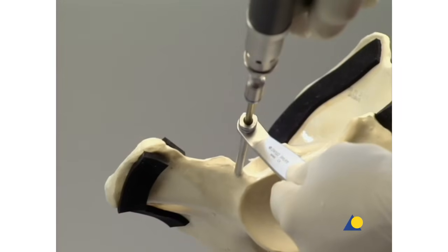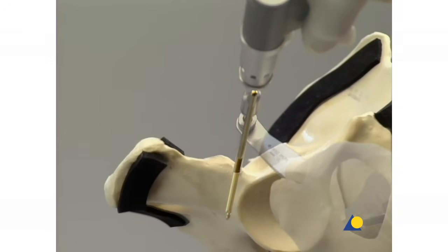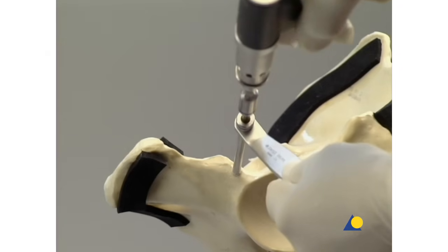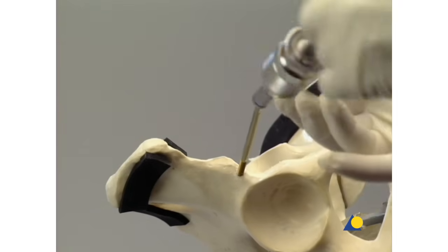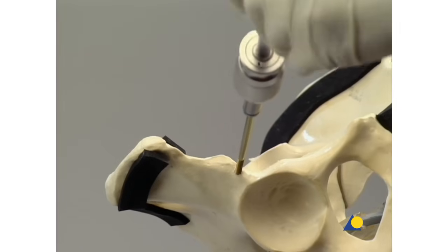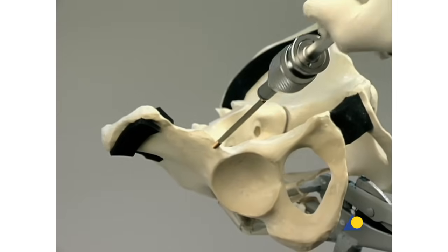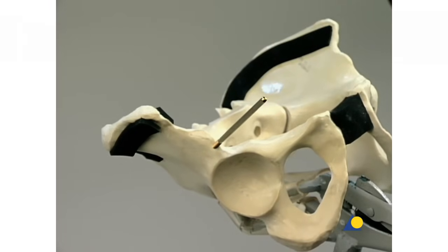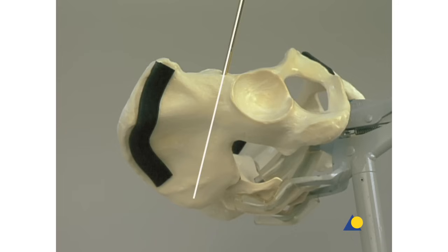The self-drilling Schantz screws can be cautiously introduced with the air drive. Care is taken to ensure good purchase in the bone. The air drive and the drill sleeve are removed. The final turns must be completed by hand, so the universal chuck with T-handle is mounted. In its correct position, the Schantz screw lies deep and firm in the bone, allowing considerable forces to be transferred in both the ventral and dorsal parts of the pelvic ring.